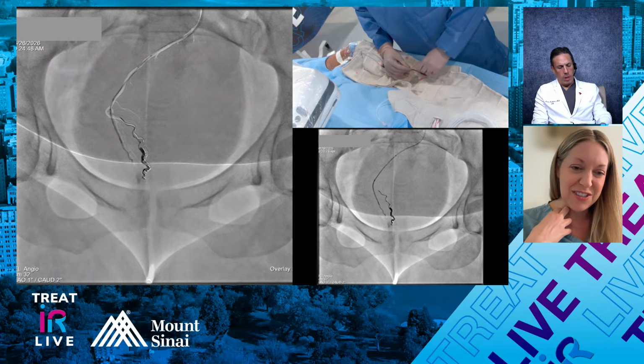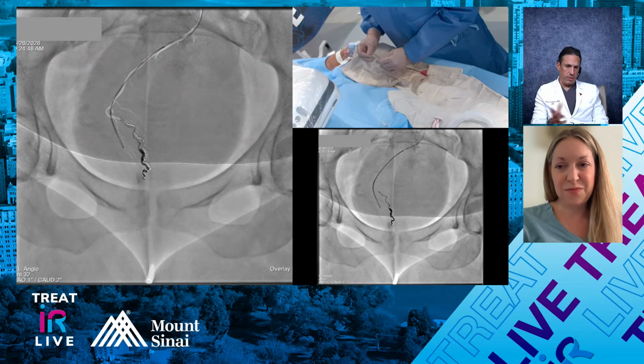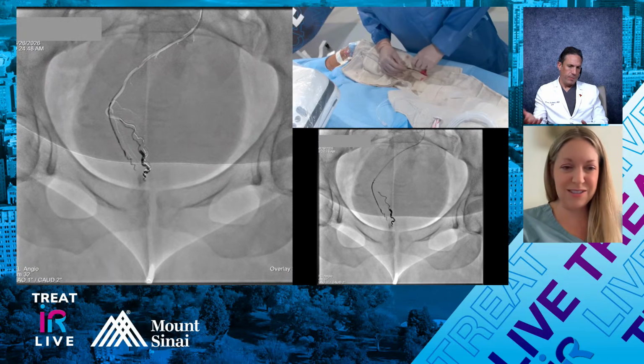The other issue with liquids, Jesse, is that we have to do so many different vessels, and we've been using the same microcatheter, and microcatheter.